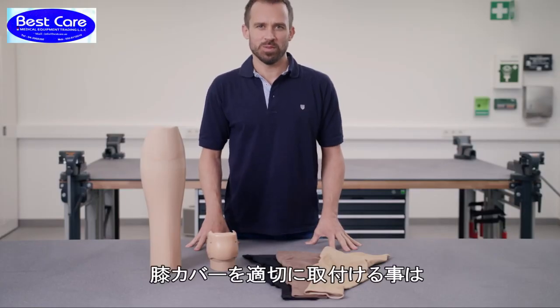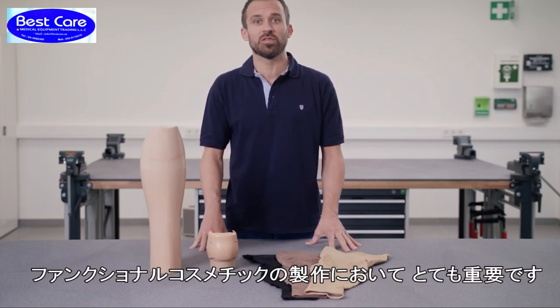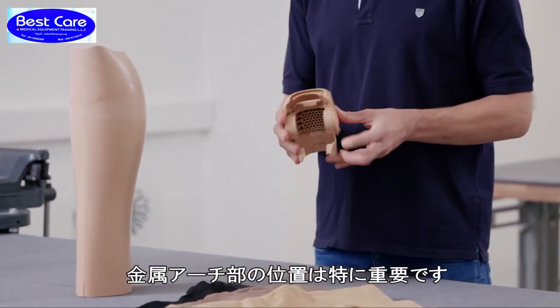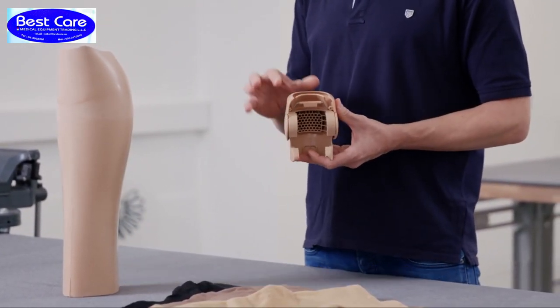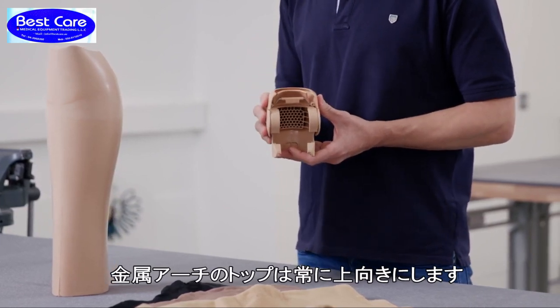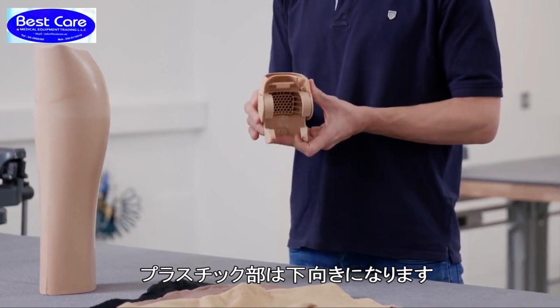A functional knee part that fits properly is of crucial importance to the success of the functional cosmesis. It's key that the metal bracket is in the proper position. The curve of the metal bracket must always face upwards and the plastic part mounted on the bracket must face downwards — like this.